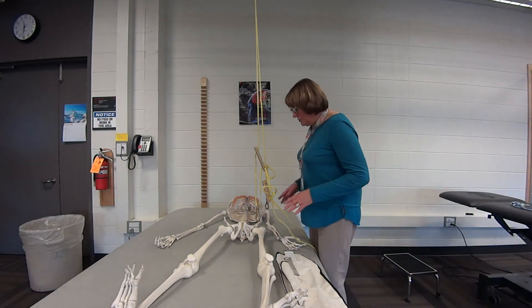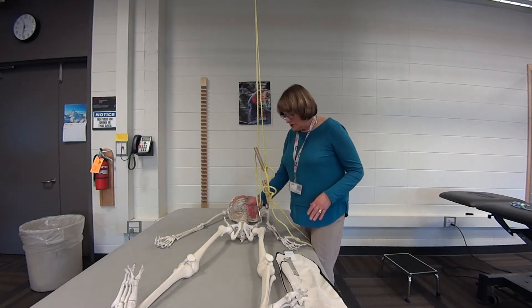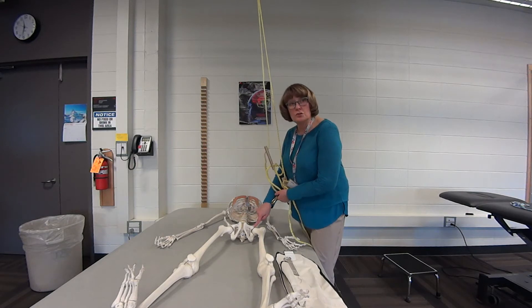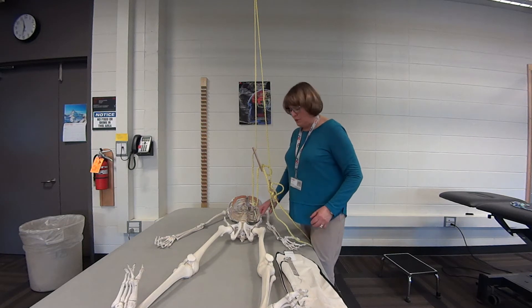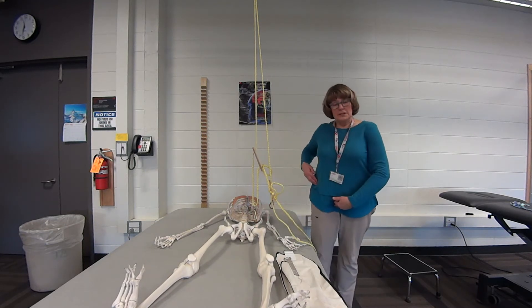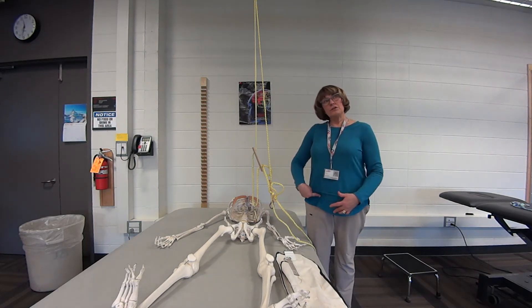I'm going to show you how to set up the slings on your patient. You always want to make sure that your sling is over the joint or the axis that you're moving from. That's your go-to starting position because then you have free movement. This is right over the hip joint — on a person it's halfway between the pubis and the ASIS.